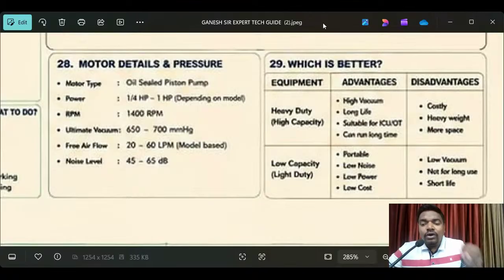Those are low duty motors, so that much load is not sufficient for the performance. So whenever you find this, you have to advise the hospital management: sir, madam, this is low duty, and in the operation theater it is not possible to use it continuously, please change it. You have to give the recommendation, otherwise the complaint will come repeatedly.